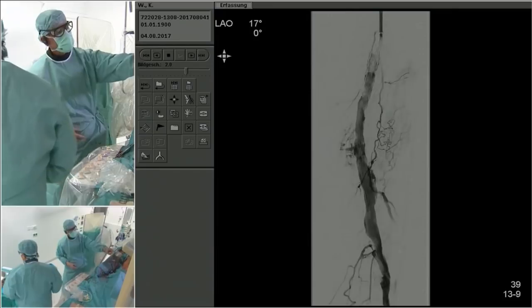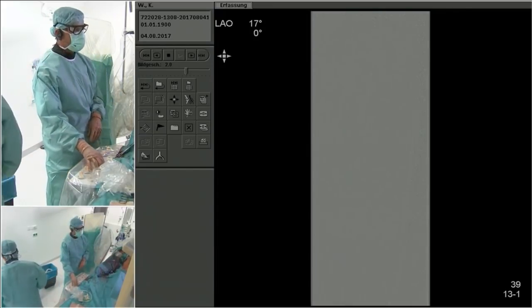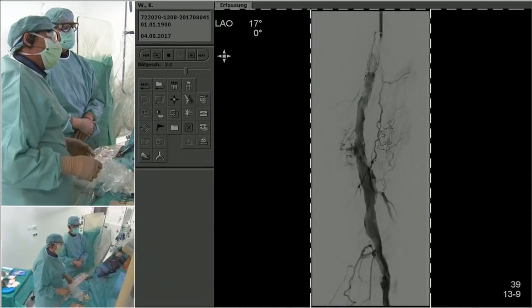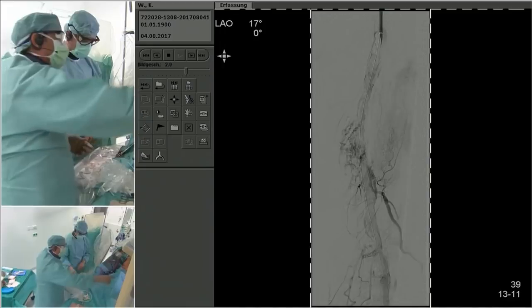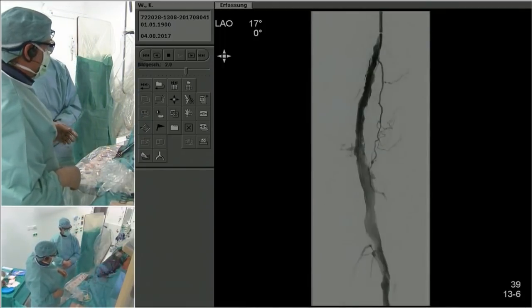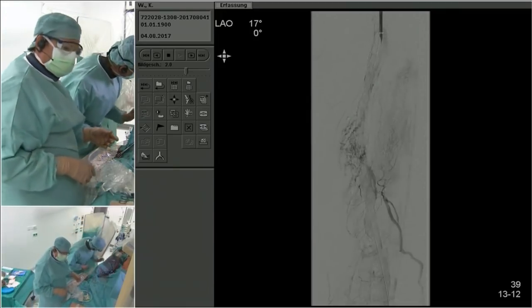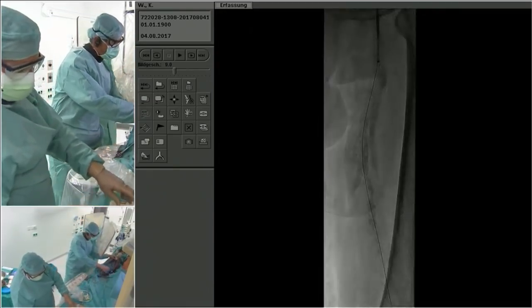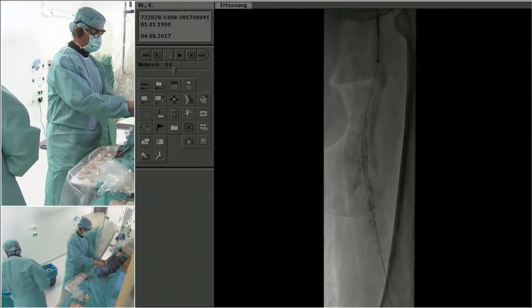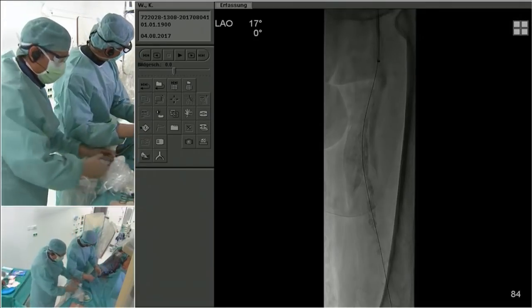How many of you would now agree that this vessel is looking more and more like a covered stent with a Viabahn? I think it makes me a little bit uncomfortable leaving this without a Viabahn right now, at least personally. And so now we have rupture really and multiple areas of extravasation. So Andrej, at least personally from my side, looks like a Viabahn may not be a bad option at this current stage. Many of my panelists do not agree, nodding their heads and shrugging their shoulders, but if they have other options, I invite them to say it right now.